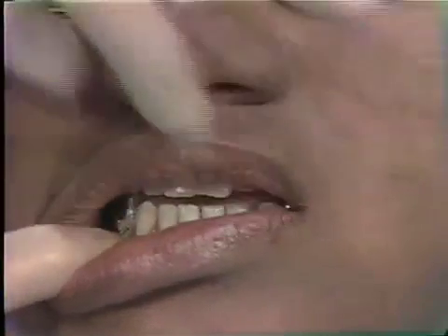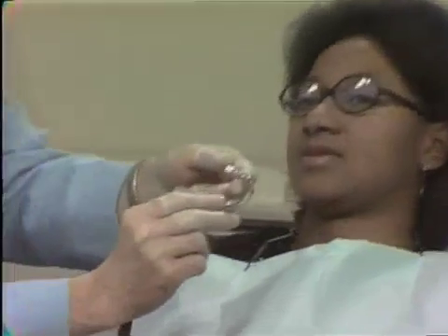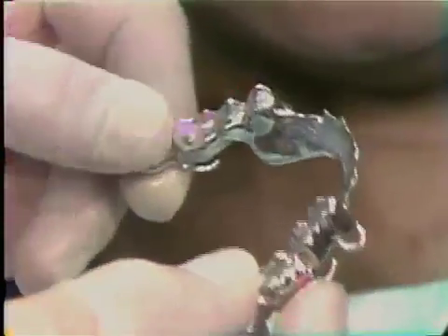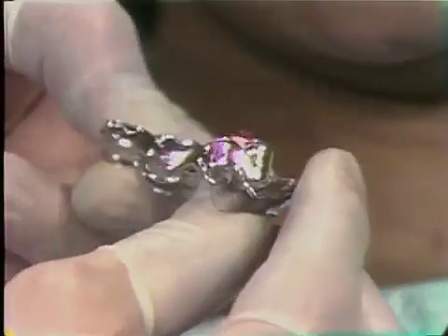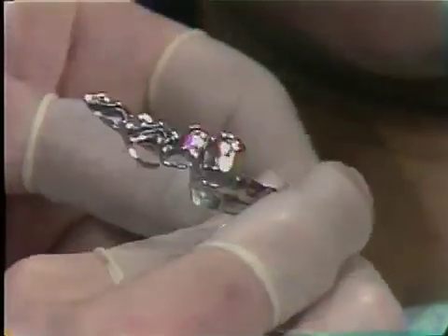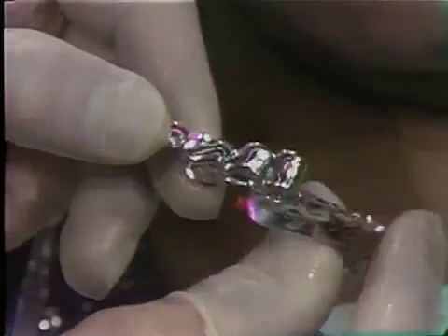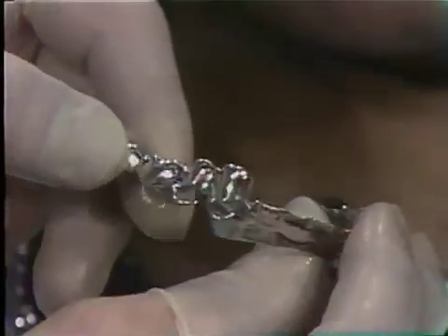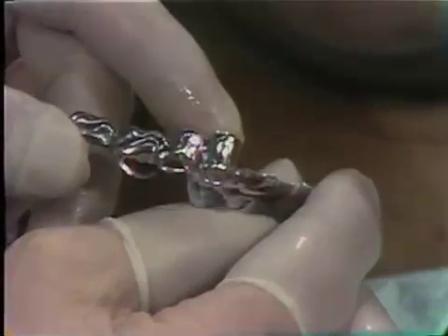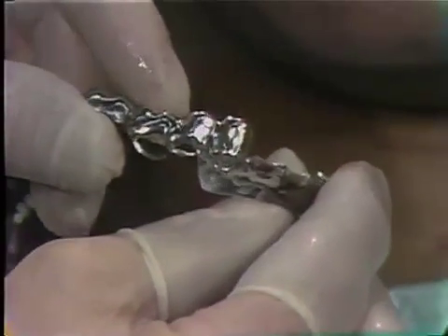As you can see after removing the appliance, it's a well-made appliance. It uses clasps to secure the appliance to the teeth, but all of the increase in vertical dimension is in the posterior part of the mouth.